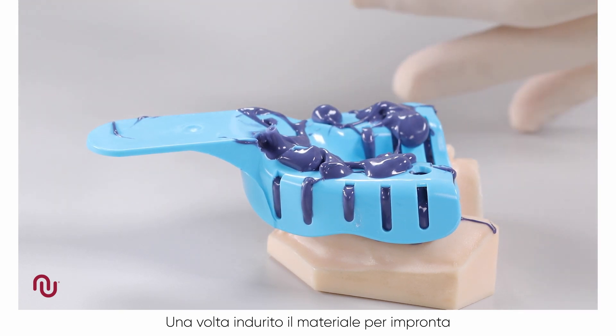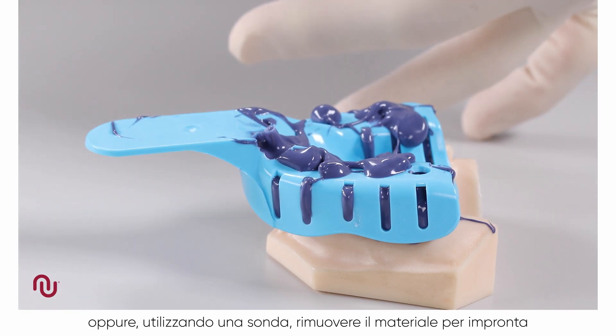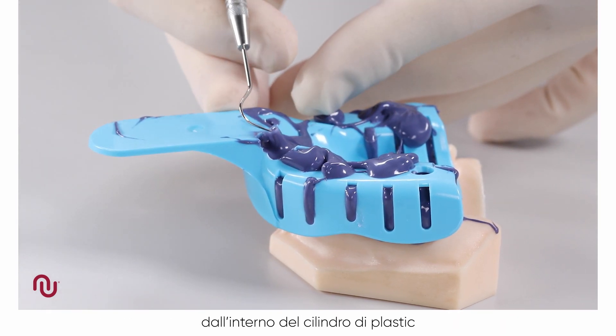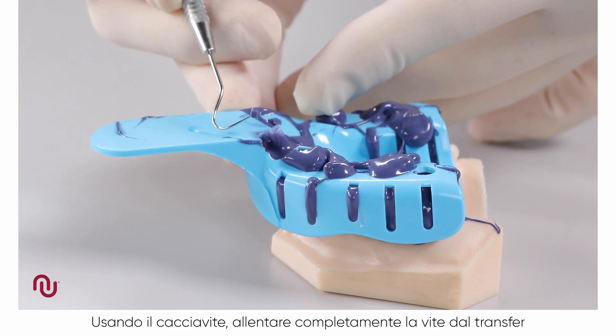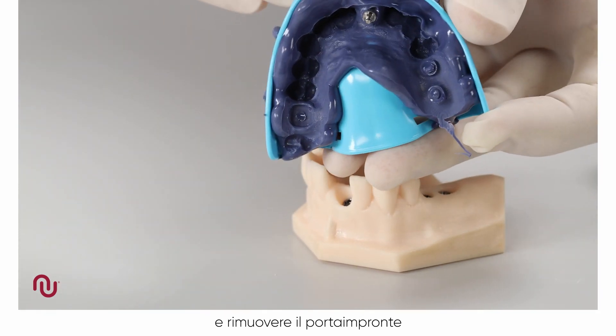After the impression material has set, either grasp the plastic sleeve with tweezers and remove it, or using a probe, remove the impression material from inside the plastic sleeve. Using the screwdriver, ensure that the screw has been completely undone or disengaged from the coping and remove the impression.